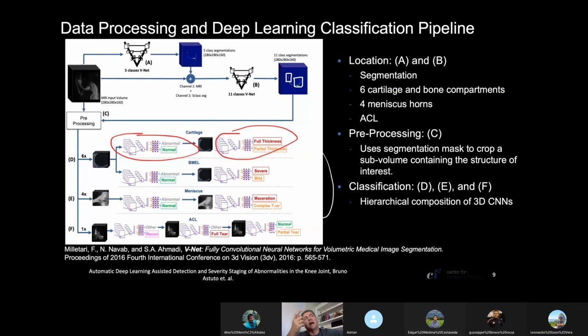And I'm thinking about the features of the lesion, right? The features of the lesion in the femur are different from the lesion on the meniscus or on bone marrow. So the nature and geometry of the features is very different depending on each problem. So that might be one of the reasons as well we didn't try a model to solve all the problems.